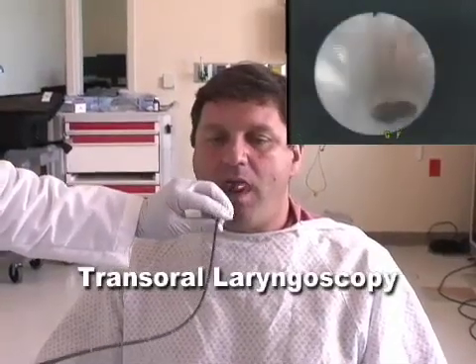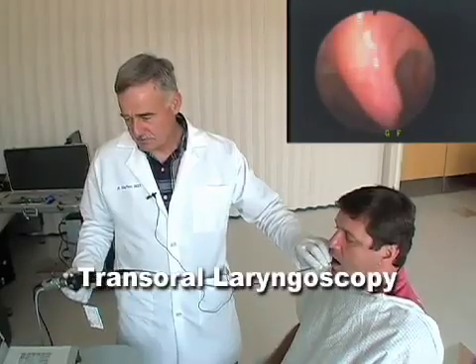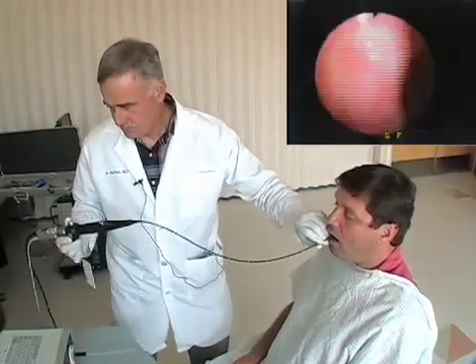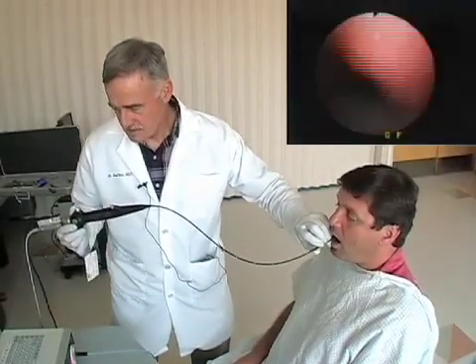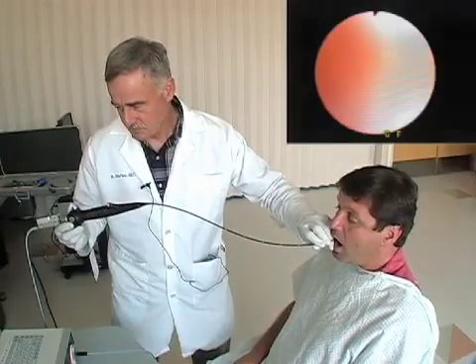Here we go. As you can see, the tube is going down. Here's the uvula. I'm going to go just past the uvula. Say E. Beautiful shot of the vocal cords.